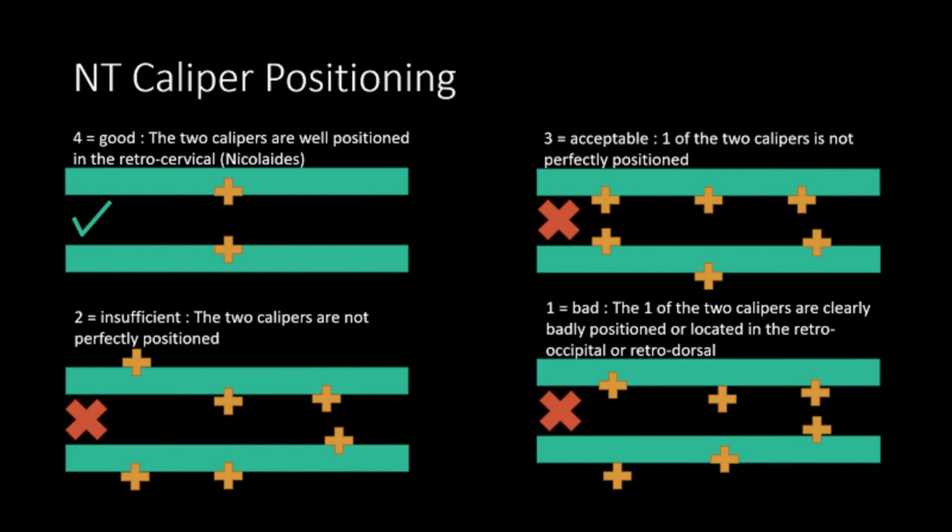If you're stressed every time you measure the NT because the baby won't stay still and your numbers jump all over the place, this video is for you. That tiny difference in where you place your calipers can completely change a patient's Down syndrome risk assessment. Today I'll show you exactly how to get a clean first trimester NT image, the neutral neck position you should accept, and the precise in-to-in caliper placement so you stop over measuring the NT and second guessing yourself.